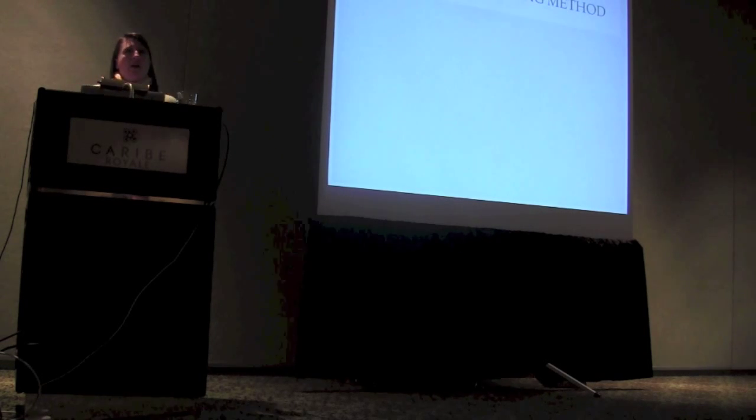And I think that in our classrooms, with our kids who are included, we use open-ended questions with our speaking kids. And we use closed-ended questions with our non-speaking kids who use AAC. And I think there's a perception that it's more efficient because it's only one button, right? So the child only has to hit the button and say TP. And I think there's also the issue of the teacher knows that TP's been programmed in, but might not know what other words are in the system that they could use to participate. So it's easier from the educator's perspective for them to just say TP.